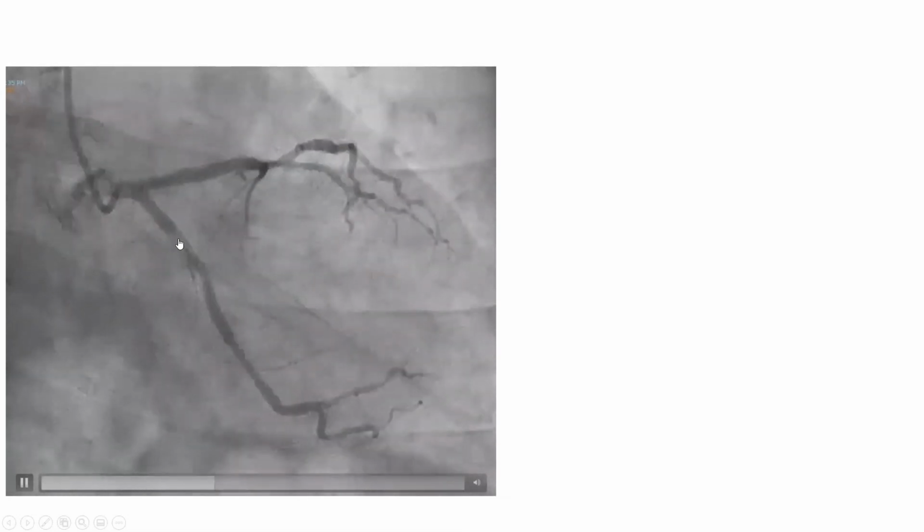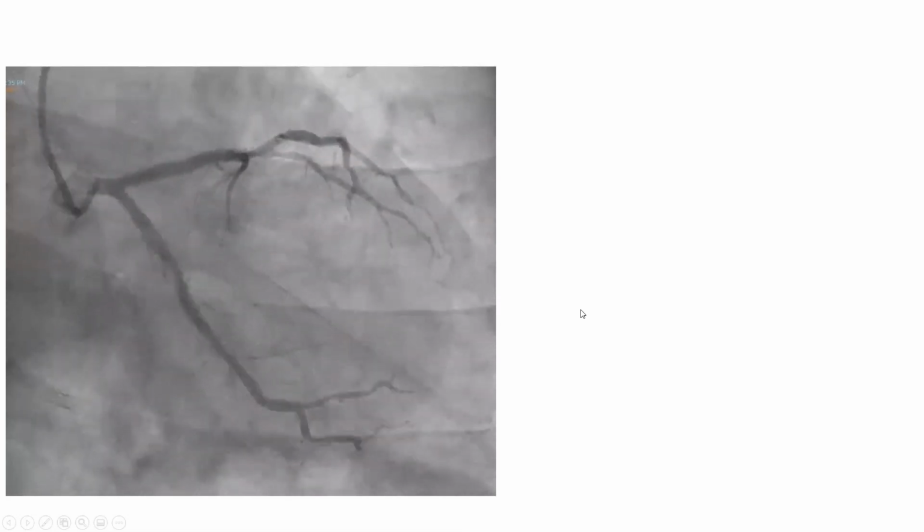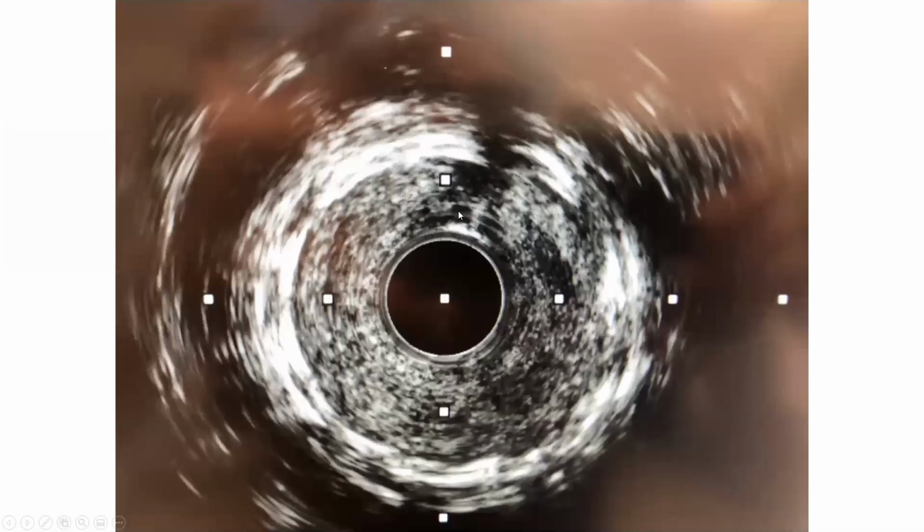It's a 2-layer in-stent restenosis. So we did IVUS here. And you can see here by IVUS, he has 2 layers of stents. You can see the 2 layers, okay? 2 superimposed layers. First, assess stent expansion. Well, the stent is very well expanded. As you can see, the distance between markers is 1 millimeter. So the stent is expanded to 3 millimeters, which is a nominal stent size and which matches the distal reference lumen. So it's well expanded.